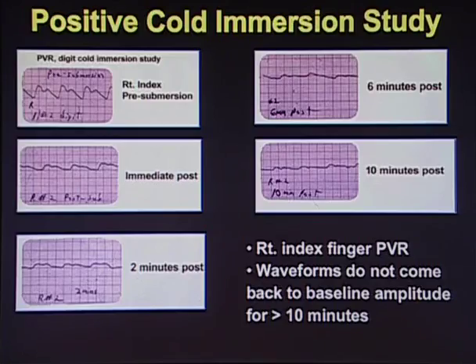This is a case of a positive cold immersion examination. It's a little bit older study, but it was quite demonstrative for vasospastic disorder. This is a pulse volume recording taken from the right index finger, and this is the pre-submersion amplitude and morphology of the waveform. We immerse the hand for 2 minutes.